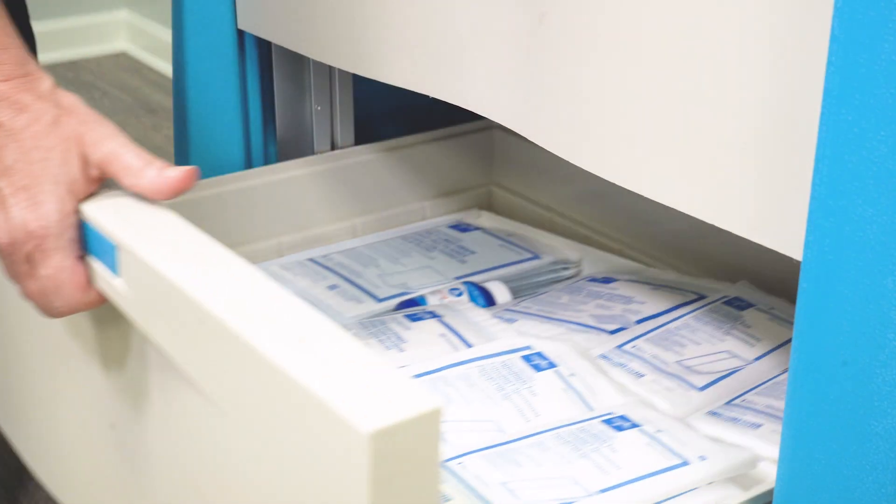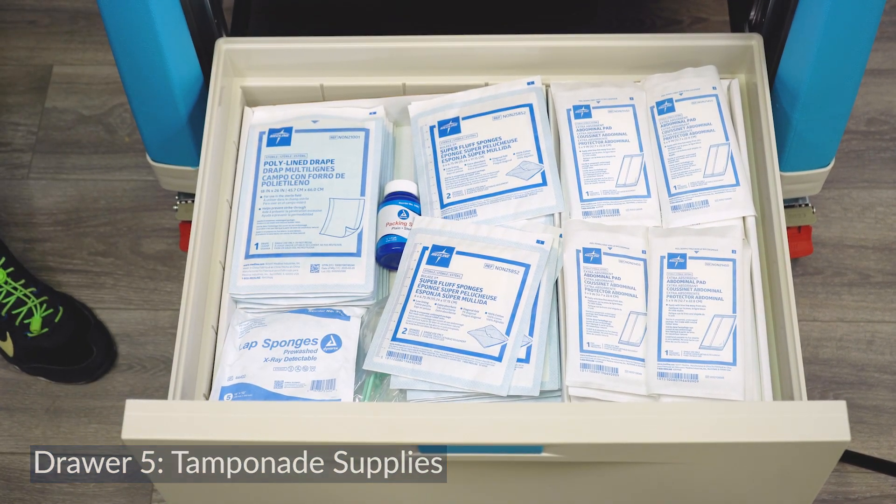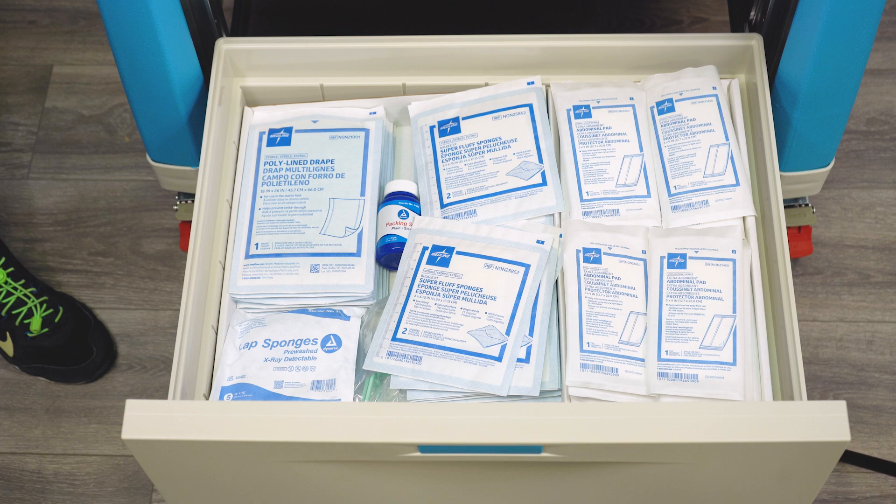The bottom drawer has tamponade supplies to control bleeding from the uterus. A variety of gauze sponges, ABD pads and wound packing strips are included.